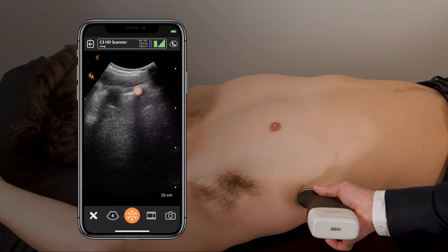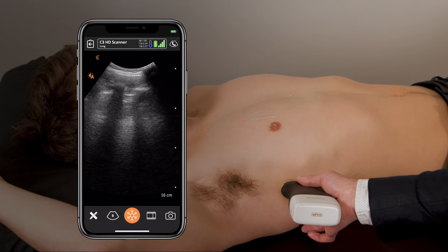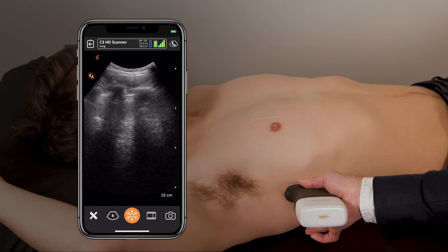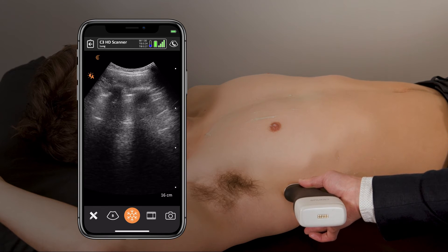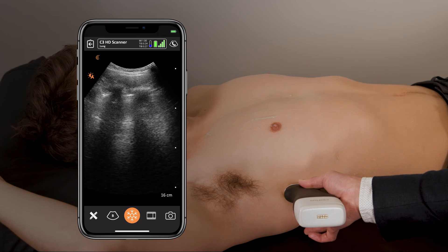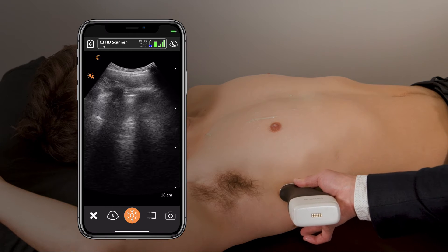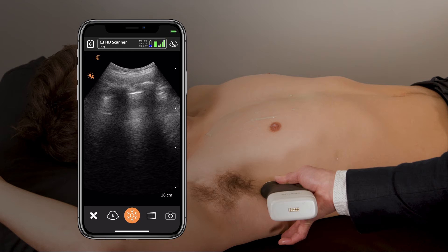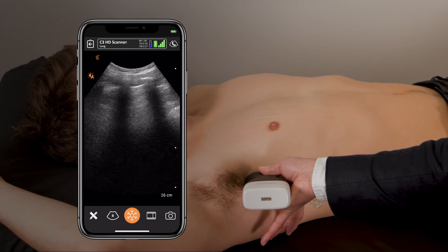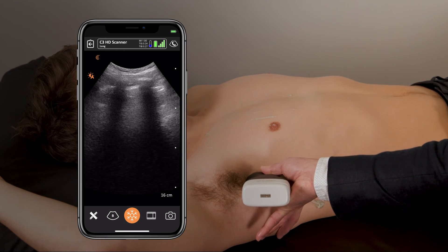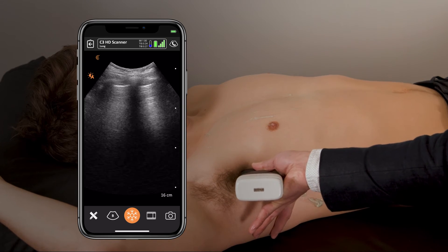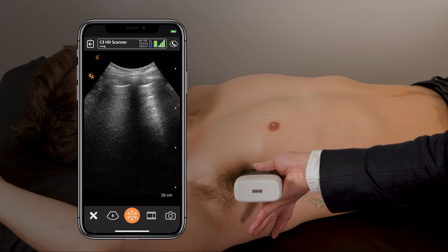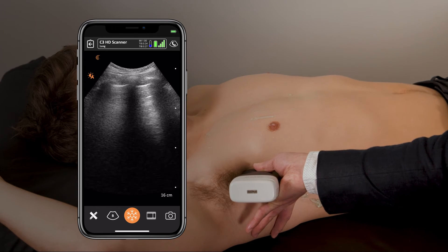If there is no pleural effusion, slide the probe upwards until you get visualization of your typical landmarks — the ribs and the pleural line. We see normal sliding. To be more comprehensive, continue scanning up towards the upper axillary aspect of the lung until you reach the axilla and can't visualize any further. We can see normal lung sliding with normal A-lines.